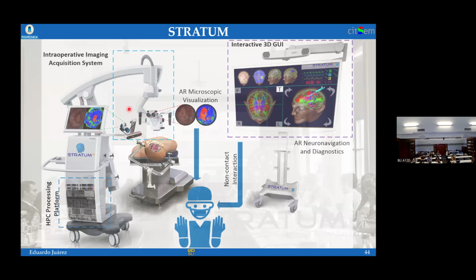We use the macro view also with the hyperspectral camera and the depth sensor, and we want to develop this high-performance computing processing platform, a processing node, to produce the results. Our objective is also to have an interactive 3D graphical interface to communicate the information to the neurosurgeons.